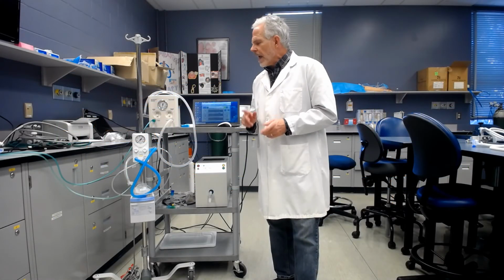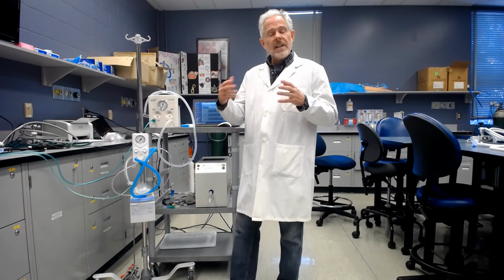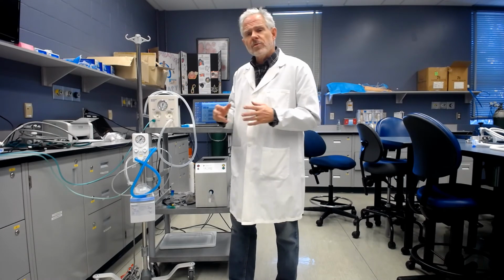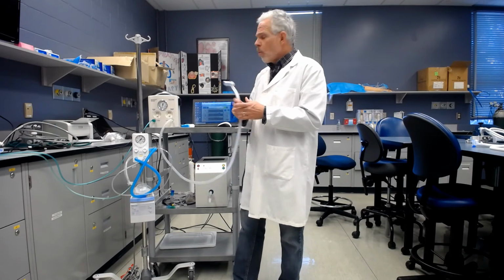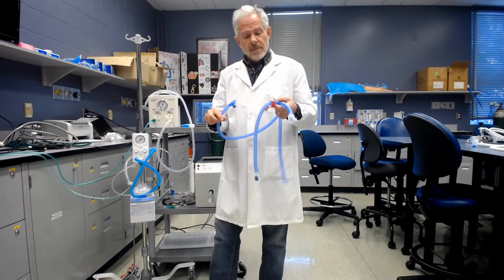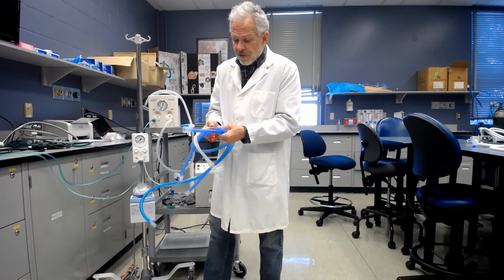Now, one of the interesting aspects that I think might be very useful to recognize with the Inspiron rPAP device is how easily it can be changed over to deliver heated humidity. We haven't traditionally been doing that with the Neopuff because it comes with a sealed pre-bought circuit with specific type fittings, whereas the rPAP has more generalized fittings that will fit literally any pre-purchased neonatal ventilator circuit. So you can easily convert this over to deliver heated humidity.